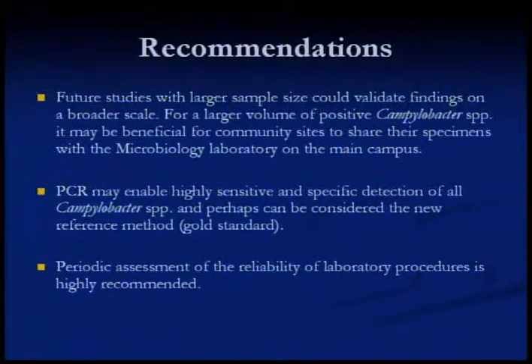It's recommended to follow any positive EIA or immunostat with a traditional culture. A PCR may enable highly sensitive and specific detection of all Campylobacter species and can perhaps be considered the new gold standard. Periodic assessment of the reliability of laboratory procedures is highly recommended.